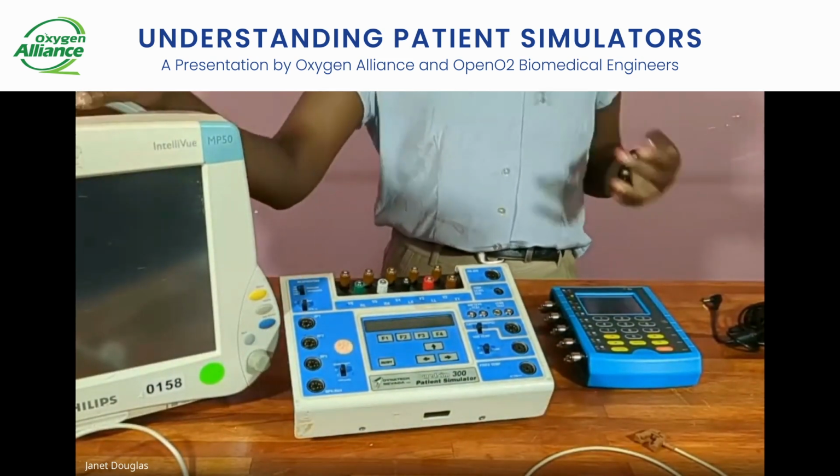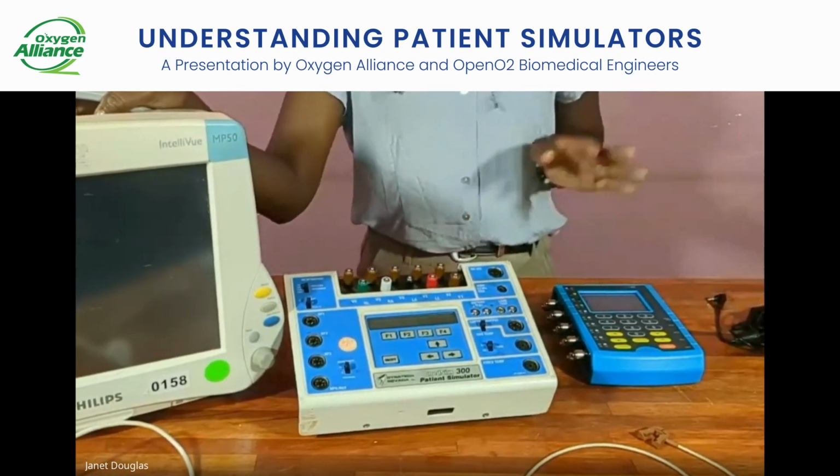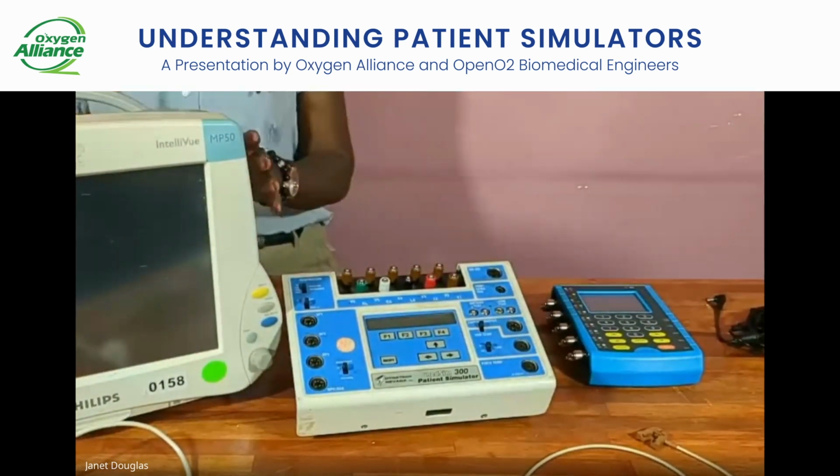So we have our patient monitor here, and we're going to use this to simulate whatever parameters we want. So I will turn on the patient monitor.